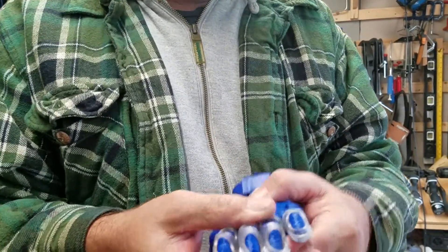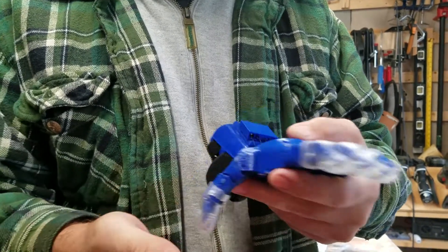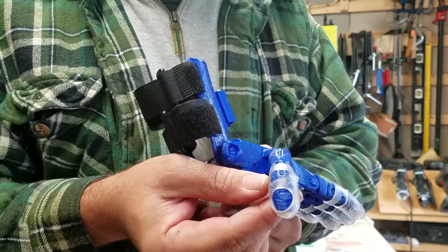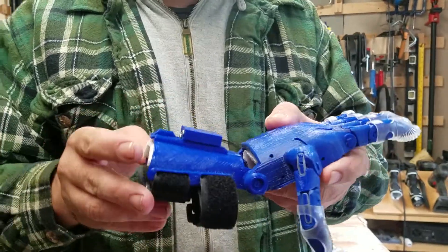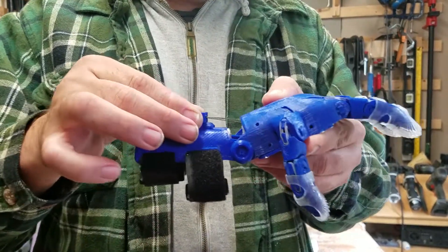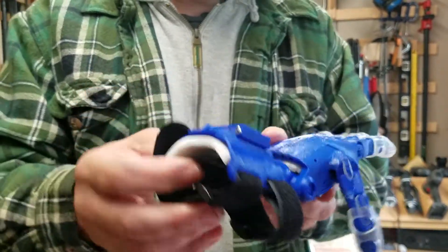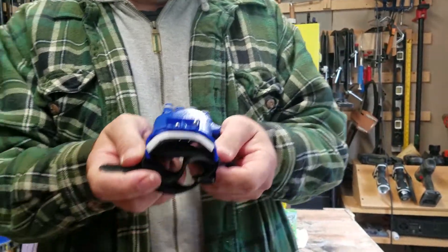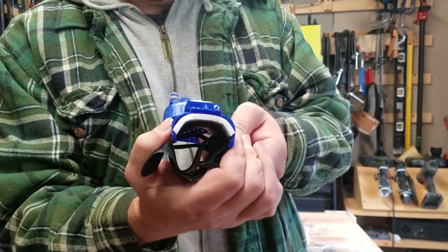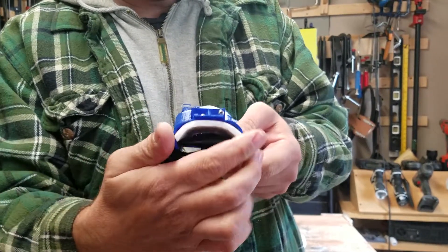The biggest challenge was the fingertips, and the thumb is a challenge as expected. The tensioner box is on there. There's a nice little tension pin here. Here's the thermal couple bent in position, and as you can see, it is nice and tough with no cracking.